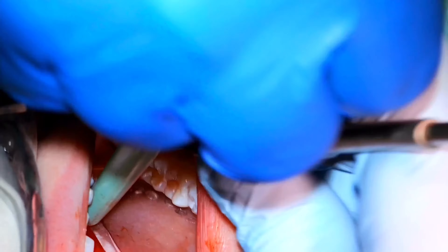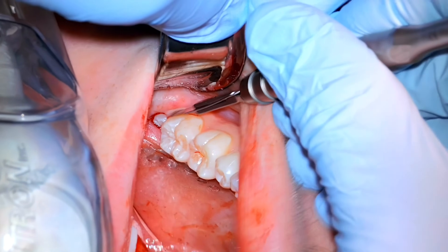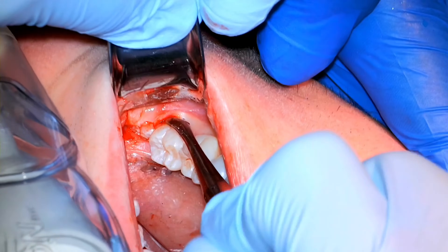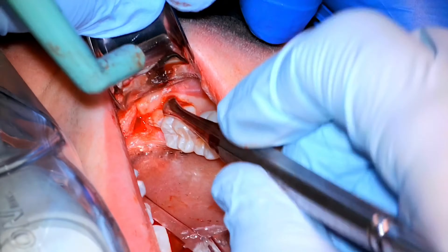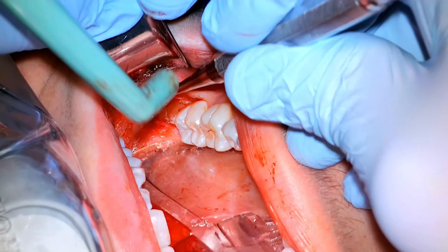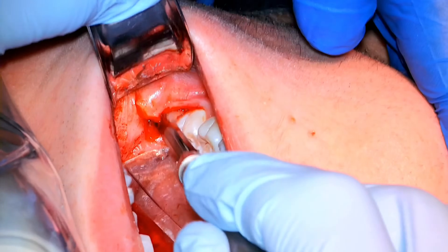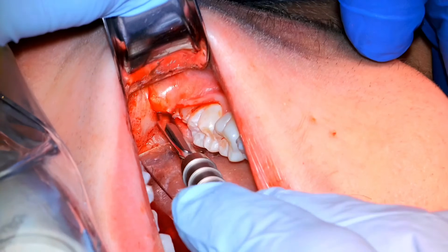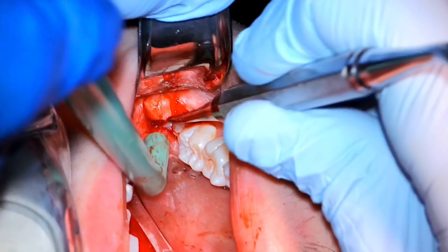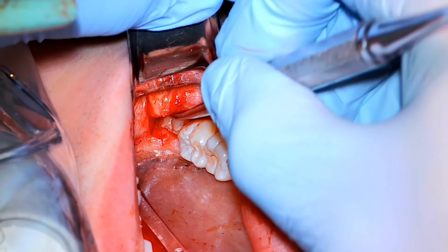Here's the other side now. You can see that tooth was partly peeking in there, which is great — we know it's near the surface. Making our distal release and then releasing that little papilla behind the lower second molar. We want to make a decent flap but nothing too crazy — we don't need a ton of access for this one. We go back with the convex side of the periosteal towards the teeth to get the flap started, then flip it over and lever up on it. After a while you get a feel for when you're under the periosteum — it has a different feel to it, not really stretching as much. You'll be able to tell when you're facing some resistance.